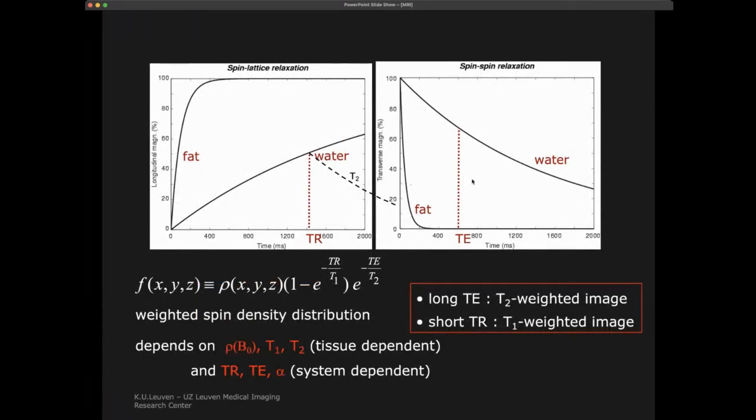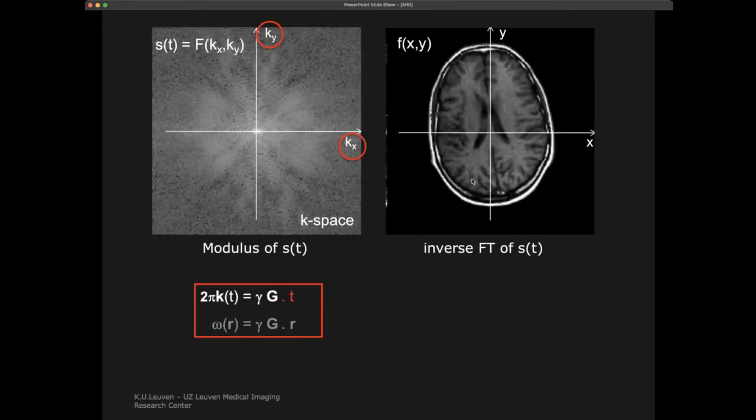Okay, now the thing is, how do we interpret it? So what now determines the amplitude of the signal that we measure? Because here what you see is the measurements are with our phase and frequency encoding. We know their position, but each pixel has a certain gray value. And that corresponds, of course, to different tissues in the measurement. So what now determines the amplitude here that we measure?